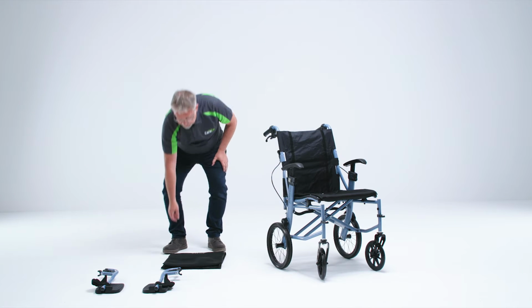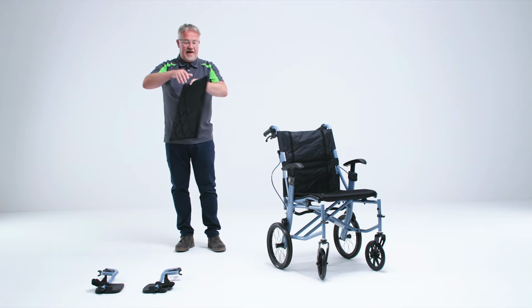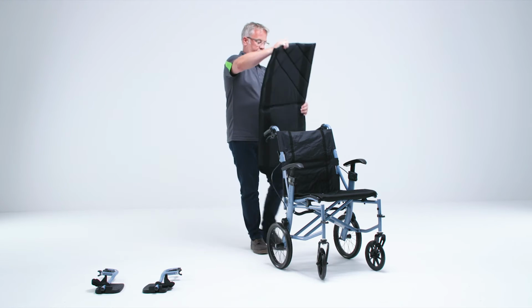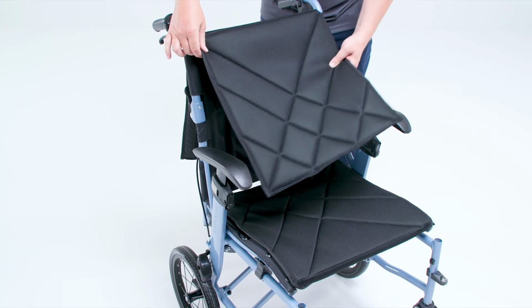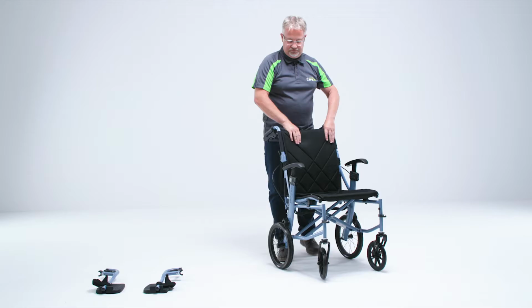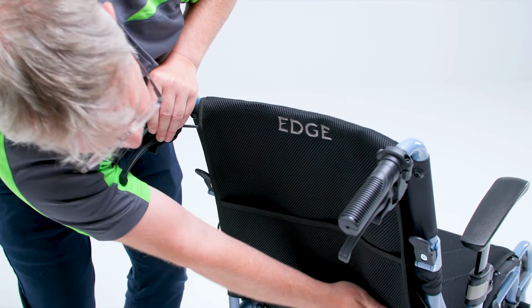Same with the backrest seat pad. The Edge symbol goes on the back. You open that out, place it over the top, and again it's held in position with Velcro on the front and also the back.